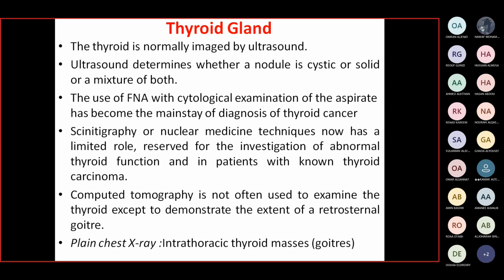To conclude this slide, we know that the most common imaging modality used in assessment of the thyroid gland is ultrasound. Ultrasound also helps in differentiating the nature of the thyroid nodule. Is it cystic, solid, or both? Also, ultrasound can be used for guidance of fine needle aspiration, the main diagnostic technique for thyroid cancer.